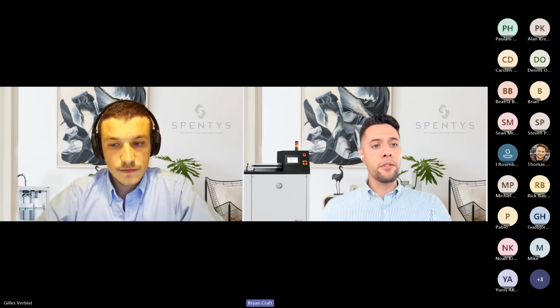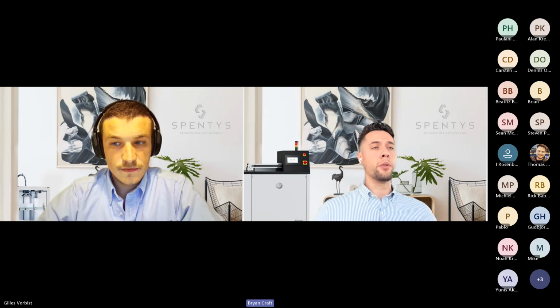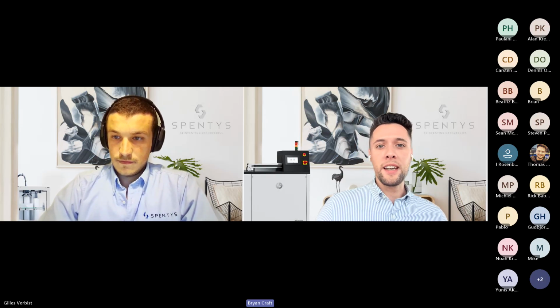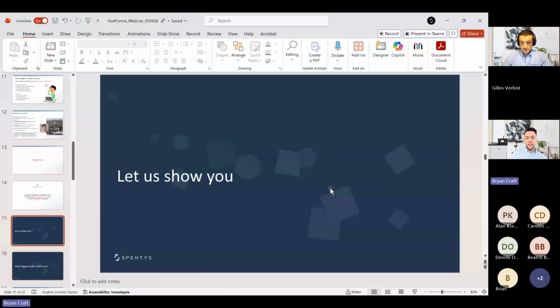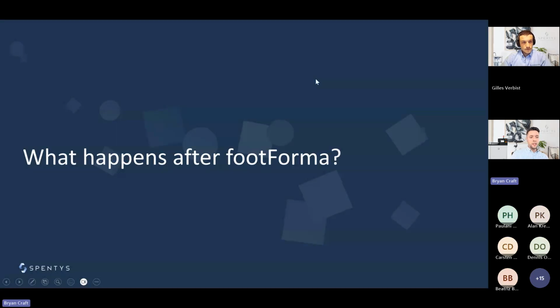So what happens after footForma, right? There's this open question of, do we go to 3D printing? Do we mill this mold and thermoform over it? What are we going to do after footForma? And that's what I have to share with you towards the end here. We are wrapping up our webinar, so if you have any questions, please put them in the comments so we could be able to answer them for you.